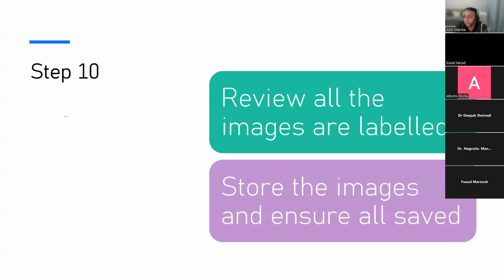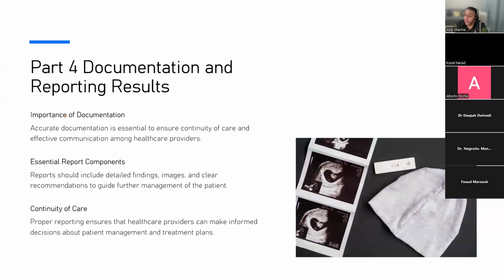This step-by-step approach is well described and will have an aide-memoire as part of your chapters. You then sit down at your screen after having saved those images and report after a second review of the still images or loops. That is the protocol for doing cranial ultrasound.